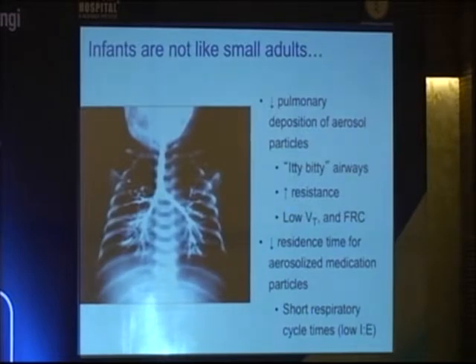And because they have small airways and they're breathing at rapid inspiratory times, there's a tremendous amount of resistance. So an aerosol will tend to fall out of that gas stream if it encounters resistance, and it has more likelihood for impaction against the sidewall of a bronchial tube. But also the low tidal volumes and the small FRCs don't allow these babies to get a lot of drug down into the lung. And you can't just tell a baby to take a deep breath and hold it, right? Especially when they're on a mechanical ventilator. It doesn't work. Trust me, I've tried it.